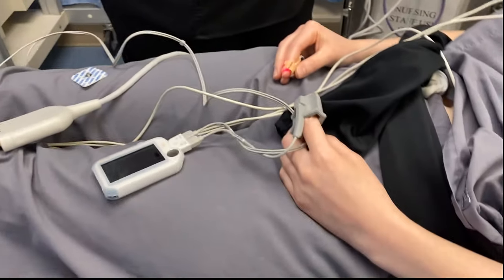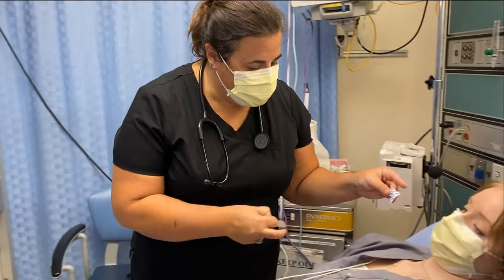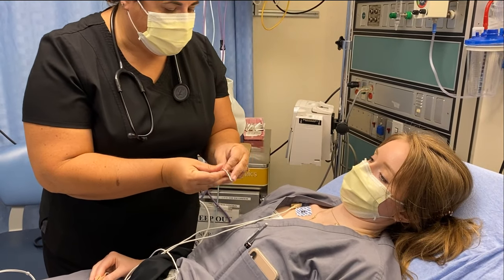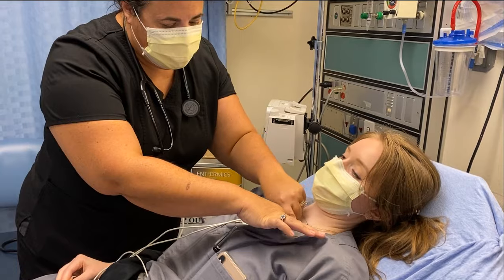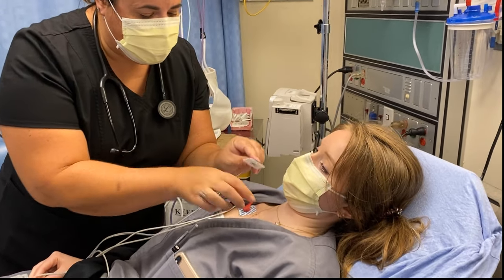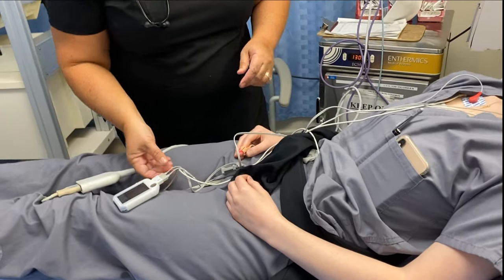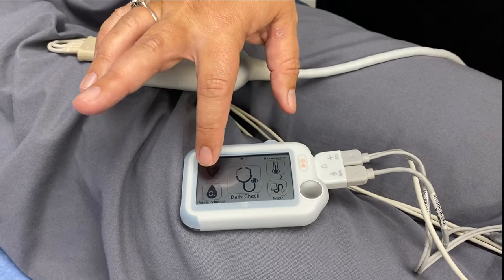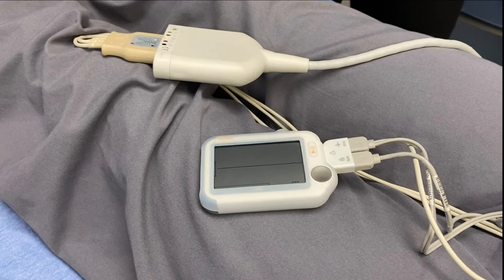Next we can do the EKG — we'll do it with the leads first since the wires are already in. She's going to get some stickers. You hook the leads up to the person — it tells you right and left: red is right, green is left. Then hit EKG and hit lead two because we're reusing the electrodes, and it'll start picking it up.